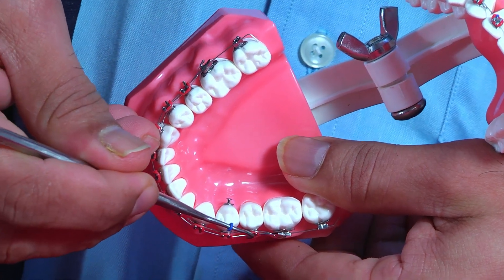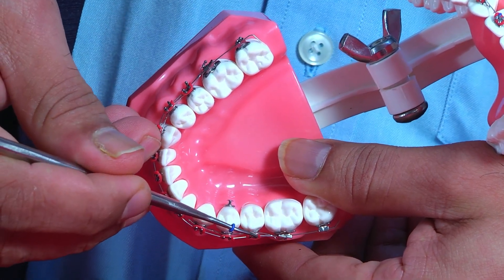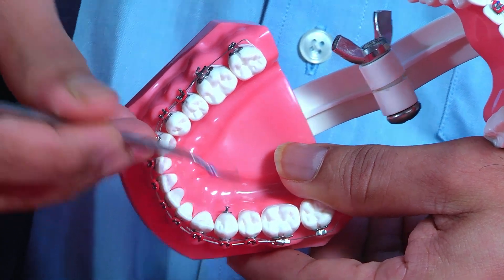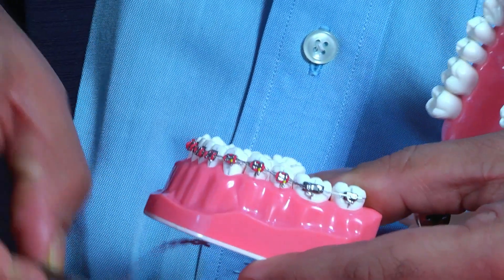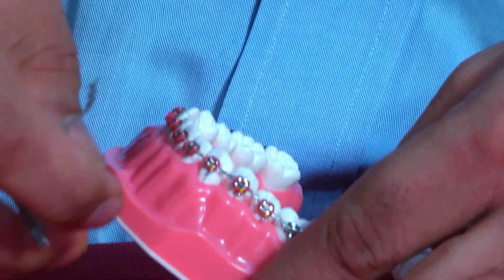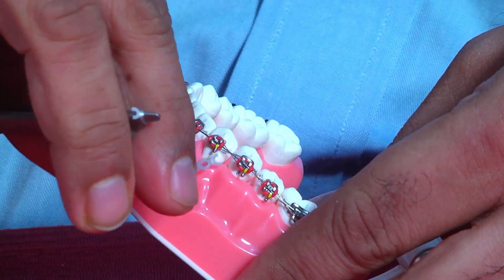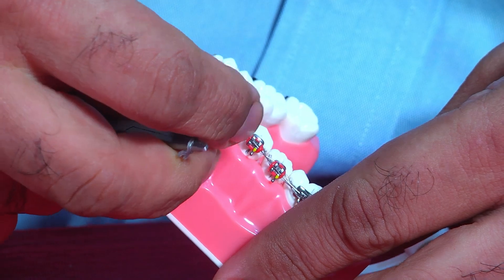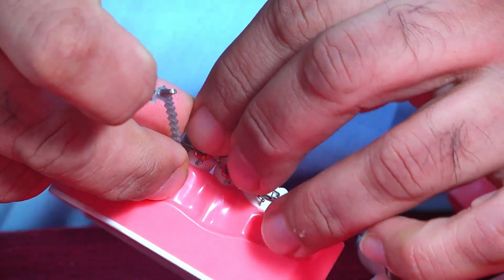If it is a distolingual rotation, the force comes from the distal. Now we have done this and then you need to tie it there. You can use this tie anywhere you want to place a power chain. And again, rotation correction should start from the beginning.